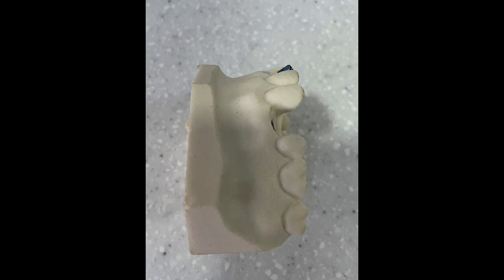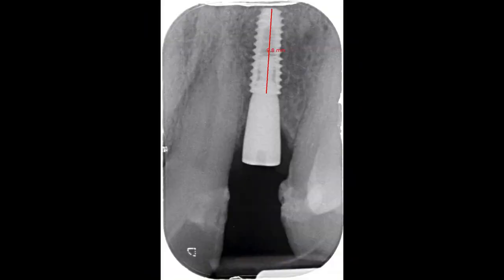And how does this actually translate in general practice? Well, this is a case that I had referred to me. This was an implant that was placed overseas, and again you can see how deep it's placed, how subcrestal it's placed, and trying to do this using a scan post and then a tie base was never ever going to happen with any degree of predictability or certainty. So I had to think of something different, and in this case the something different was the Atlantis abutment.